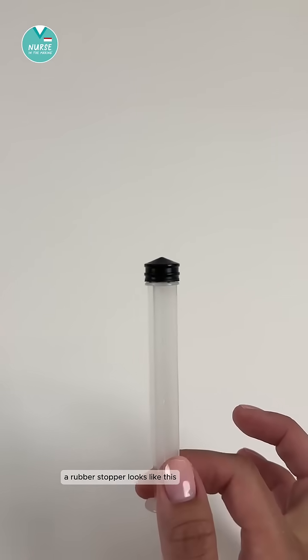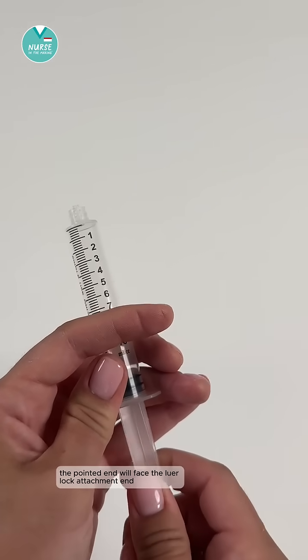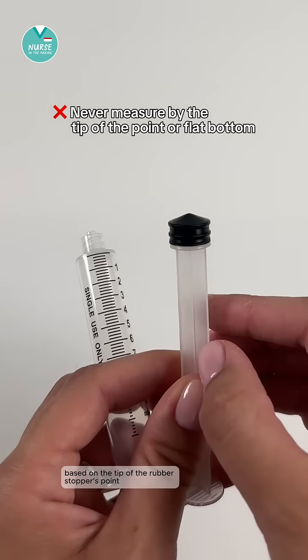A rubber stopper looks like this — you have a flat end and a pointed end. The pointed end will face the luer lock attachment end, where medication will push out.